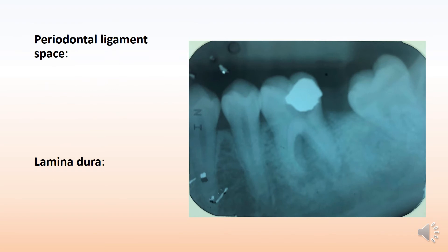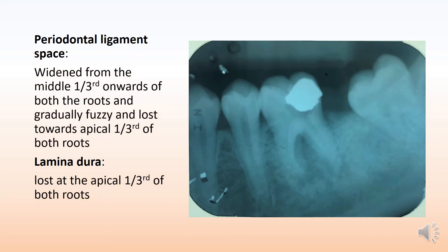Moving on to the periodontal ligament space and lamina dura — this is very important to observe in any tooth with pulp involvement. In this case, there is widening from the middle one-third onwards of both roots, which becomes gradually fuzzy and lost towards the apex. You can see the PDL space clearly from the cervical to the middle one-third, but at the apex it is no longer visible. Similarly, the lamina dura also appears to be lost at the apex of both roots.